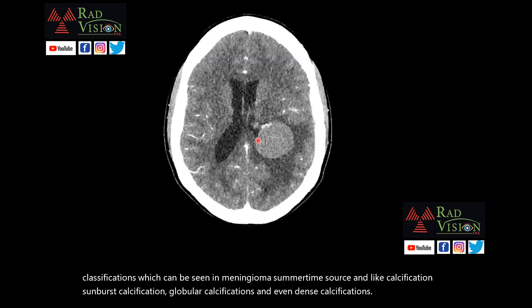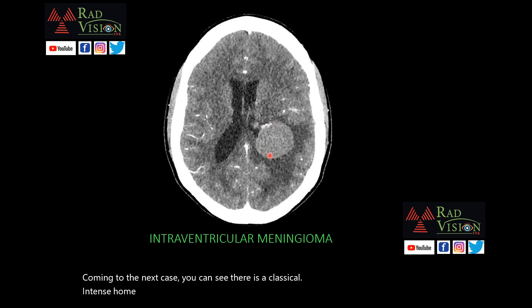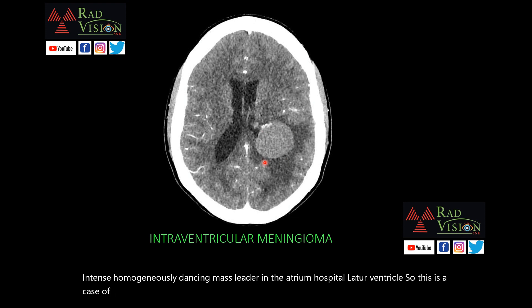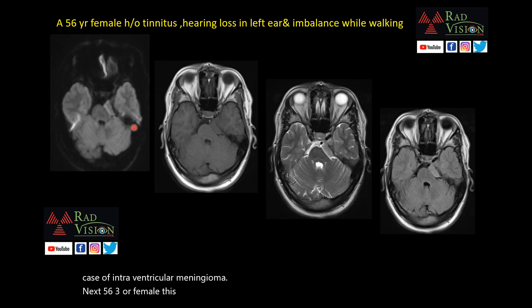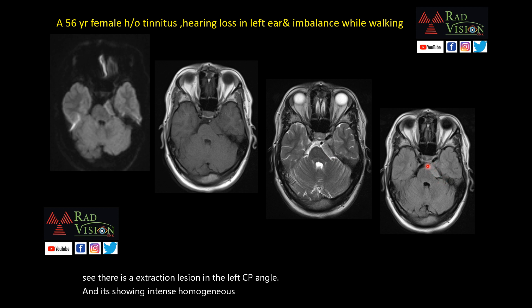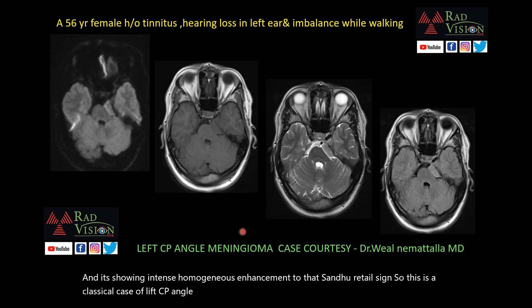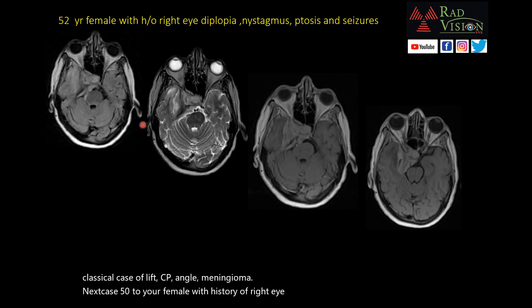Next case: there is an intensely homogeneously enhancing mass lesion in the atrium and occipital horn of the lateral ventricle — a case of intraventricular meningioma. Next, a 56-year-old female with tinnitus, hearing loss in the left ear, and imbalance: there is an extra-axial lesion in the left cerebellopontine angle showing intense homogeneous enhancement — a left CPA meningioma.